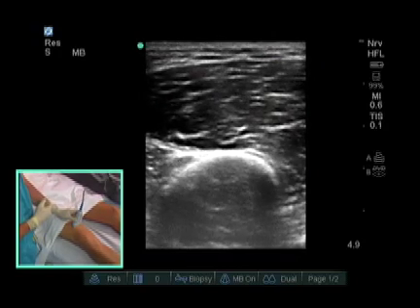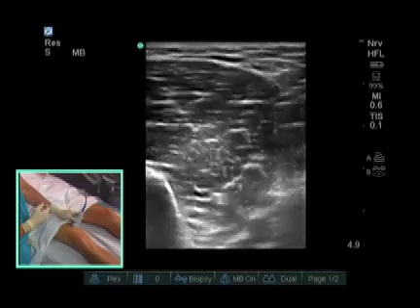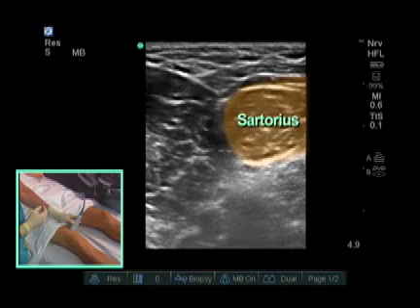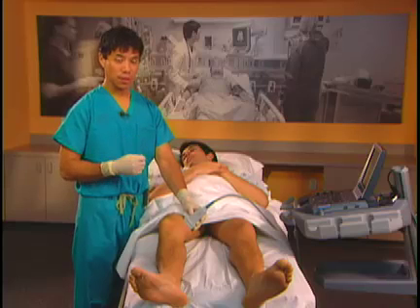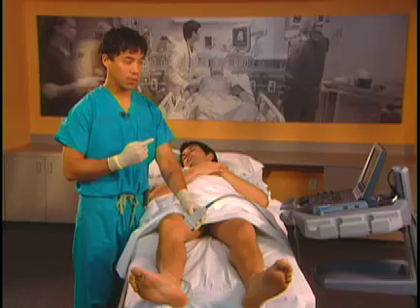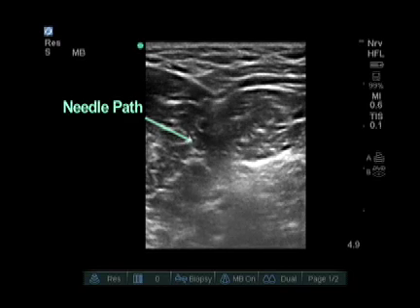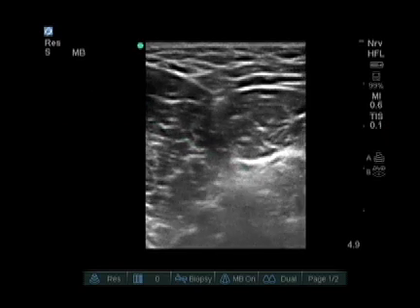We're going to slide the probe posterior. The next muscle we'll come across is the sartorius muscle. There are many anatomical differences patient to patient — the saphenous nerve can run anterior to the sartorius muscle, posterior to the sartorius muscle, and I've even seen it piercing the sartorius muscle. The key is that we will put our local anesthetic below the sartorius muscle in order to get a good saphenous nerve block.